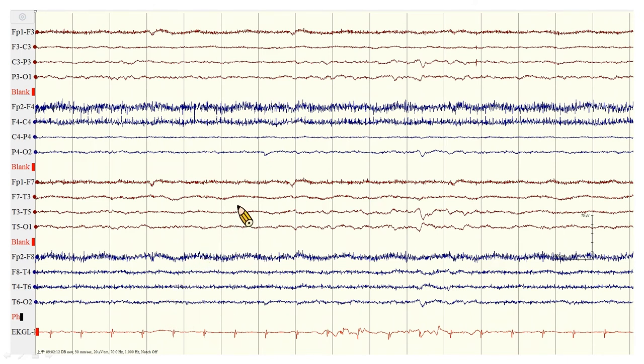We can see there are still diffuse low-amplitude waves of cerebral origin. So we can only say the EEG has generalized suppression, but not electrocerebral inactivity.